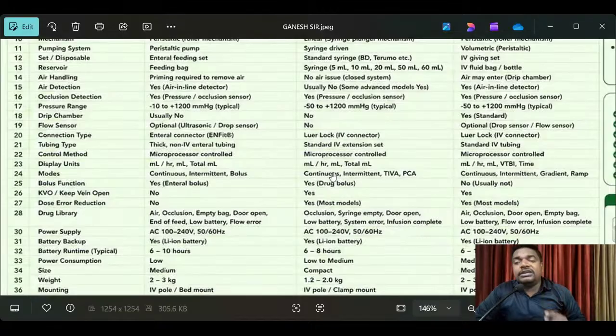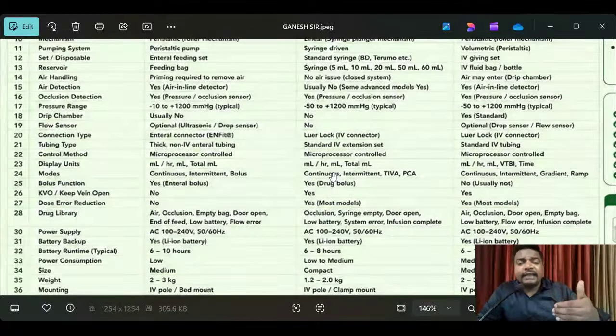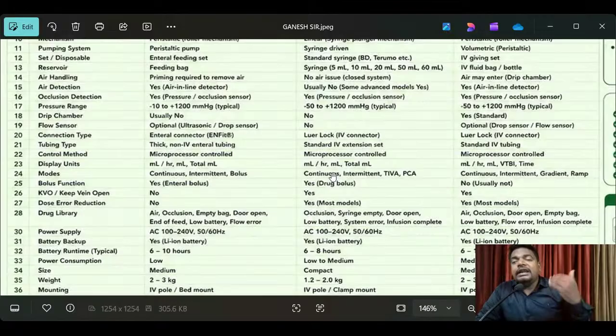So here, why I'm saying microcontrol: in every medical equipment, as I have explained in previous sessions also, every medical equipment is manufactured based on electrical and electronic components. These are the two basic things, and anything further added, like mechanical or pneumatic systems, varies the features depending on the condition of the equipment. But mainly, for the equipment to function, electrical and electronic is the important part.